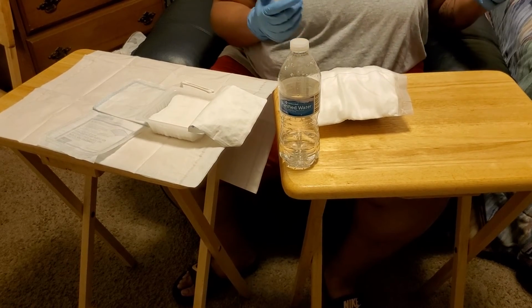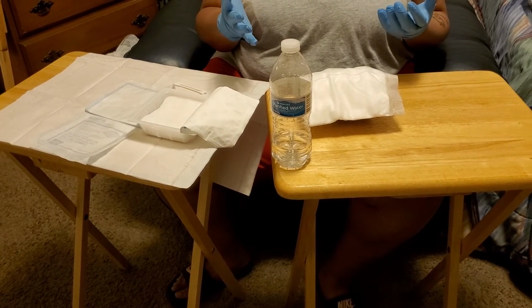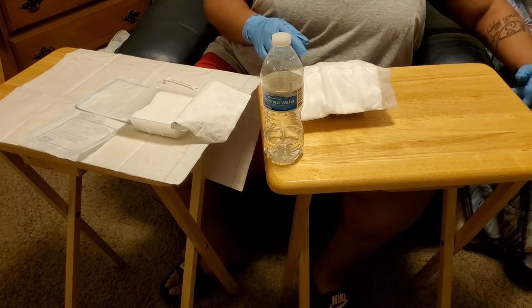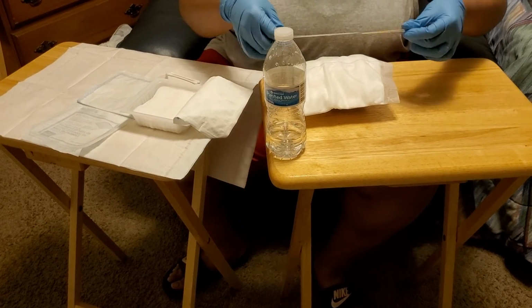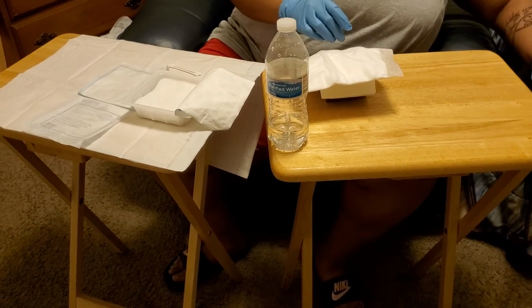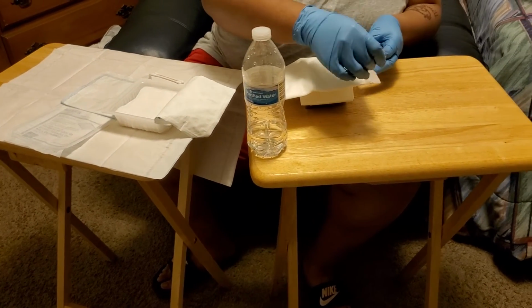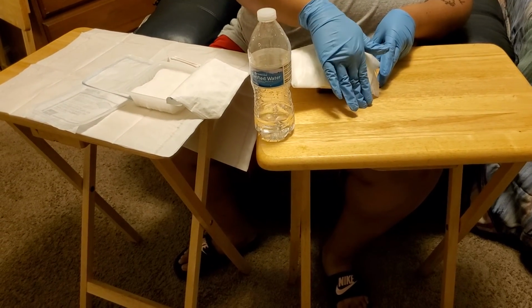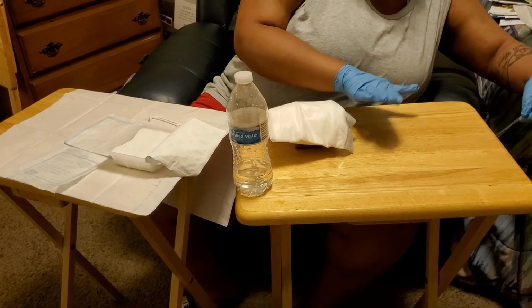Okay, and once you do that, so we've placed all of our materials there, and so the tape is not sterile, but now that we have everything there and everything's covered, we can now use our tape. Okay, so our first piece of tape is going to go this way. So there's different methods that you can use to tape the wound. My method personally is just taping around all edges. Okay, so you just want to make sure that it's taped to the wound. Okay, and so if this was an actual person, that would be flat on skin.